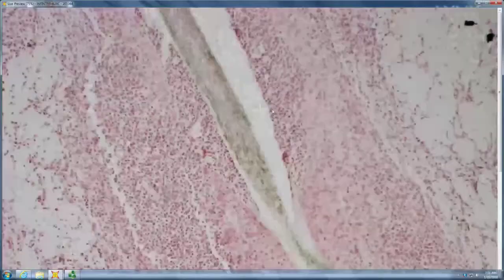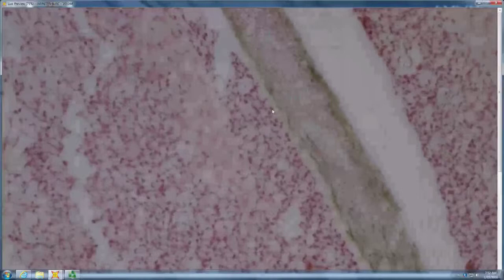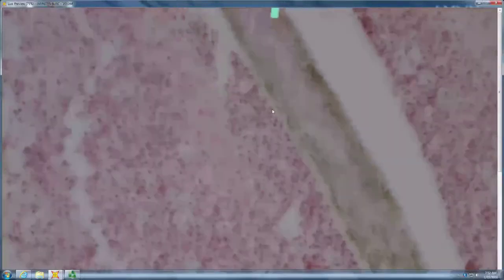Okay. And let's get. Okay. Let's do this guy. So first off, where do you think you are? Probably scalp. And what's going on in this scalp? There are little organisms within the hair shaft. Yeah, chains of spores within the hair shaft. Any on the outside? No.